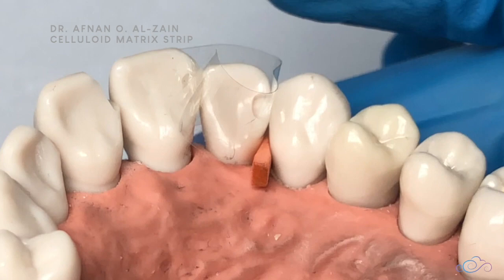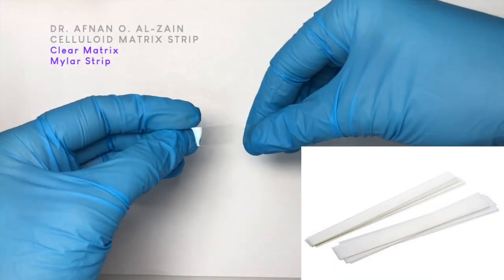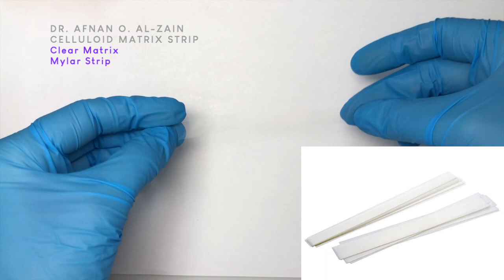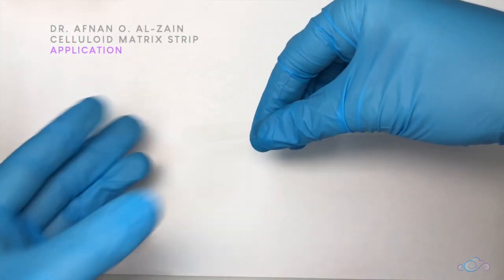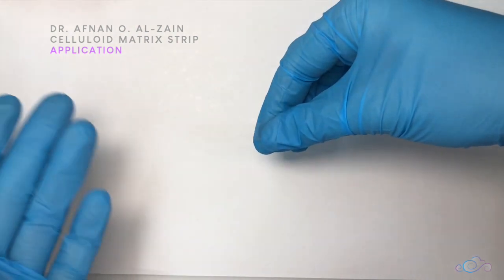How are we going to use it? It is the celluloid matrix in a long strip. It is called either a celluloid matrix, a clear matrix, a celluloid strip, or a mylar strip. We don't need all of that length.